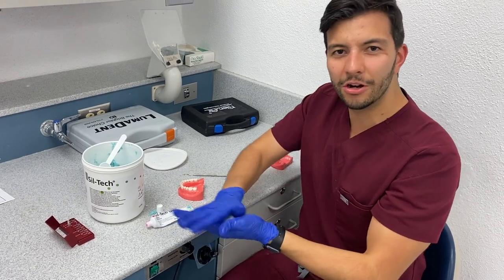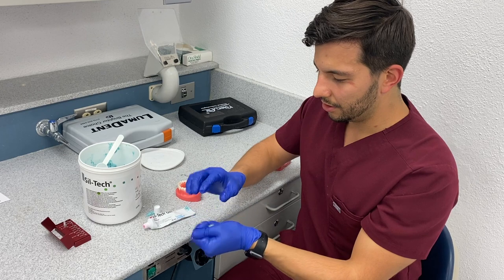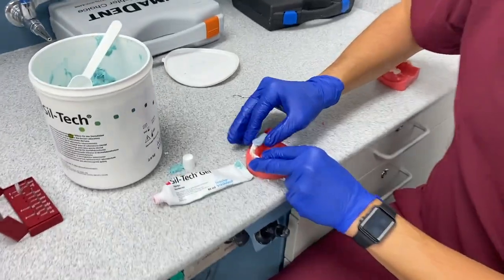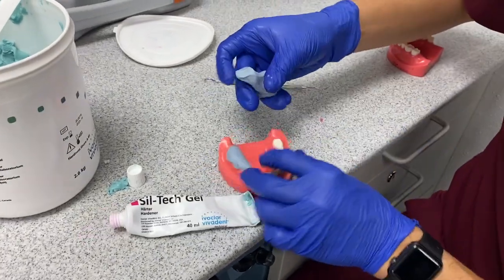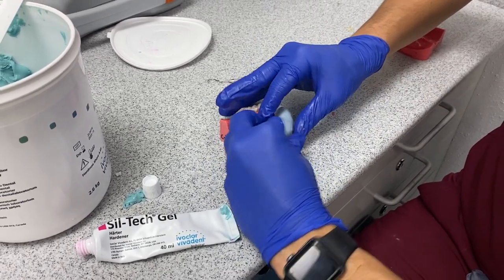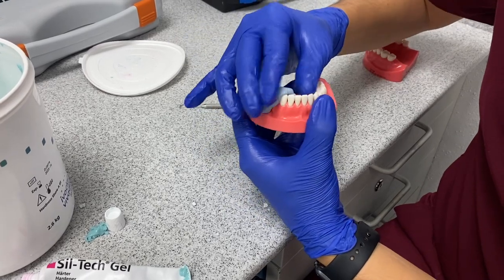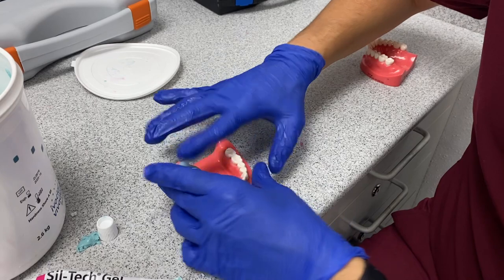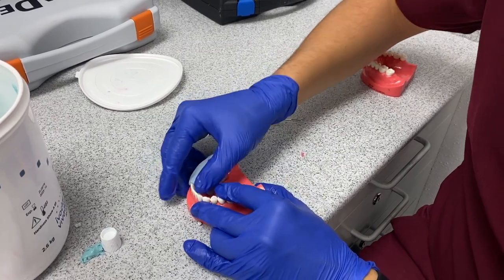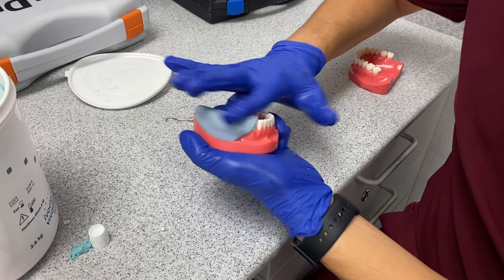You want to get the right color — it's going to be like a darker blue color — and make sure it's really uniform. Once you have that, you can grab a little piece of it and press it down onto your tooth pretty well. That way you're capturing that occlusal anatomy nicely. One tip is to make sure that it goes down to the depth of the vestibule to really capture that anatomy, because once you cut it, it's going to allow you to seat it the same way every time so you're not measuring the wrong reduction. Then just wait a couple minutes for it to set.